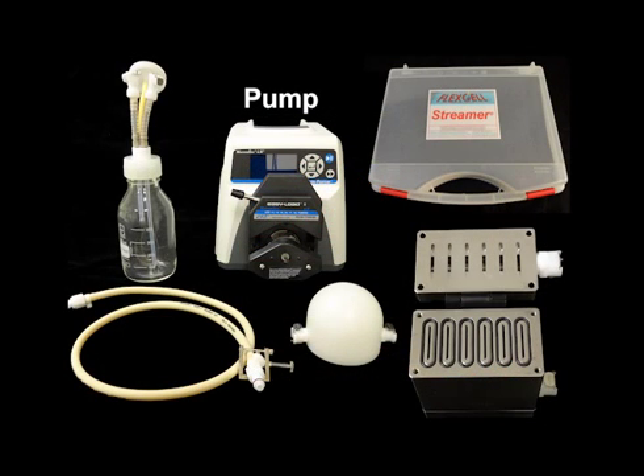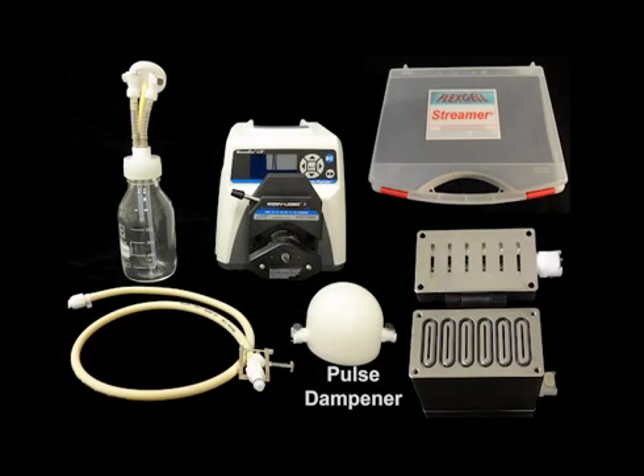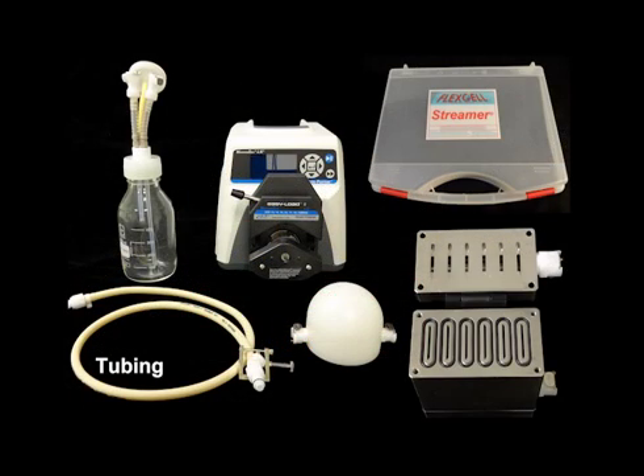Your MasterFlex peristaltic pump with power cable and the RS232 serial to USB connector cable, two pulse dampeners, the 500 milliliter culture medium collection reservoir, your Ossiflow flow controller with the supplied power cable and USB cable, and all the tubing that came with your streamer and Ossiflow devices.